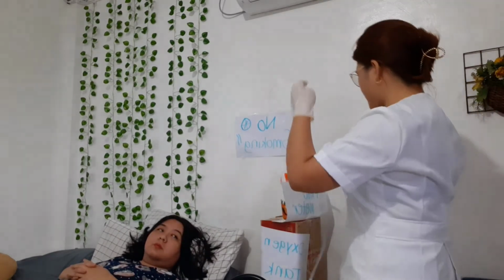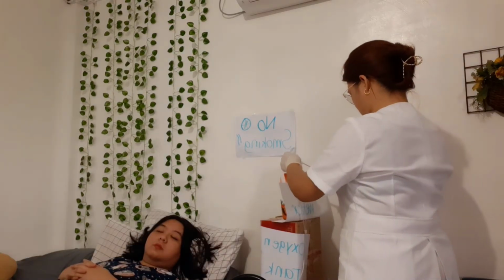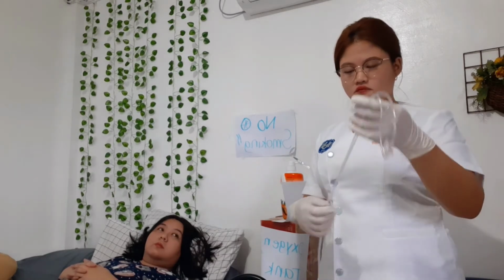It should not be rated above 6 liters per minute, so it is not efficacious and can dry the nasal mucosa. So after that, you need to facilitate the effective delivery of oxygen according to the device ordered. I will go and attach this one to the humidifier. After connecting the nasal cannula to the humidifier, you need to check the oxygen flowing freely through the tubing. So there should be no kinks and the connection should be airtight.